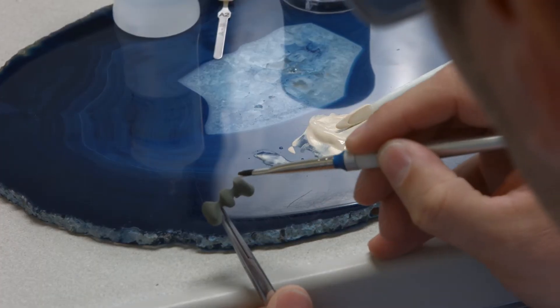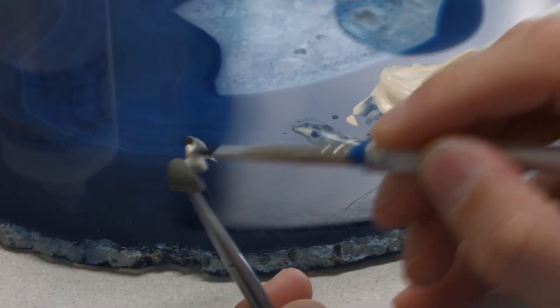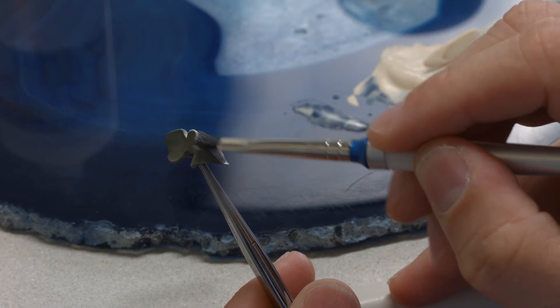Thinly apply the first opaquer layer on the clean metal framework with a brush. Agitate or vibrate it so that it settles in the micro-retentive areas.